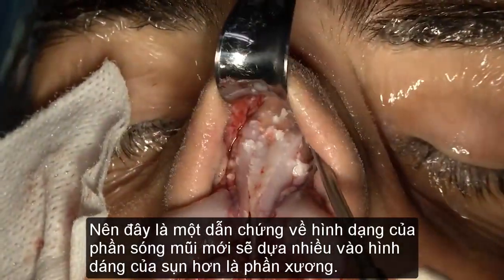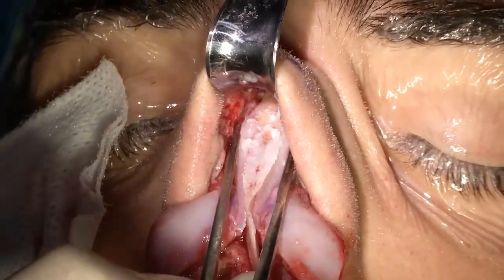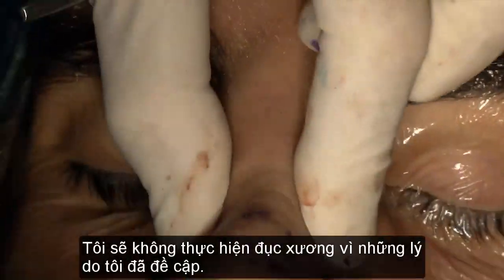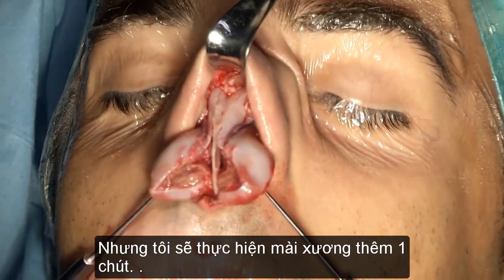So this is a good demonstration on how the shape of this new dorsum will be due to some cartilage work rather than bone. I am not going to do an osteotomy for the reasons I mentioned. But I will do some further osteoplasty.